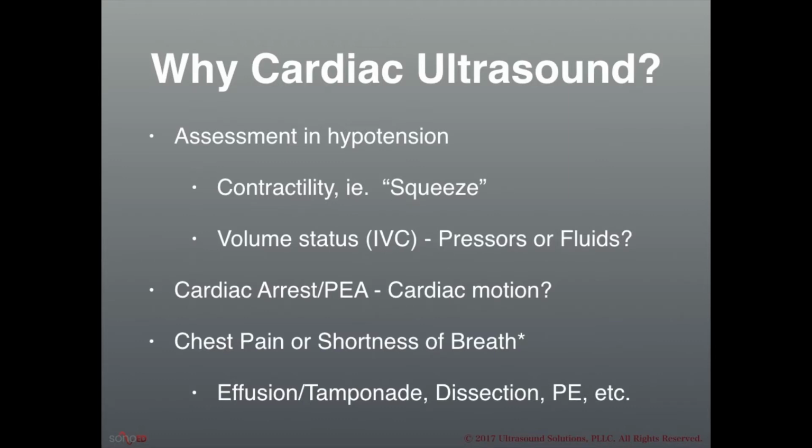And then secondarily, it's often very valuable to assess the IVC to assess that tank. How much fluid is in the tank? How much fluid is available to come into the heart to be pumped out? Now, when we actually get to talking about the IVC, you'll hear me deviate a little bit from that perspective and talk about the IVC much more as a surrogate marker for central venous pressure than the fluid or volume status in particular, but more on that to come.